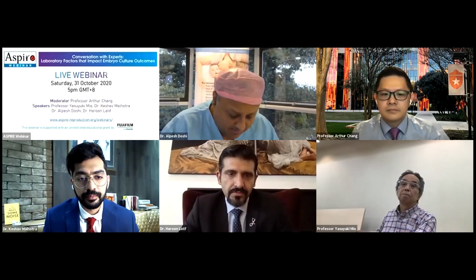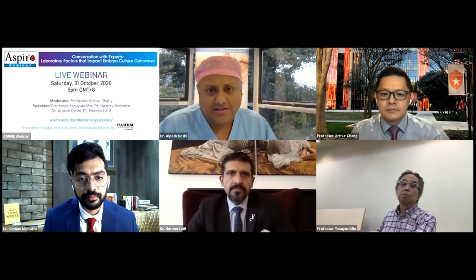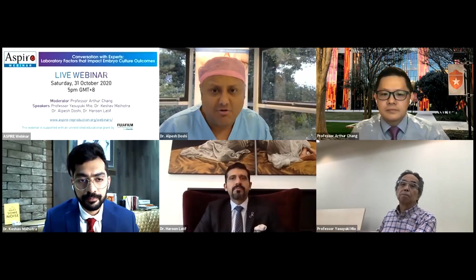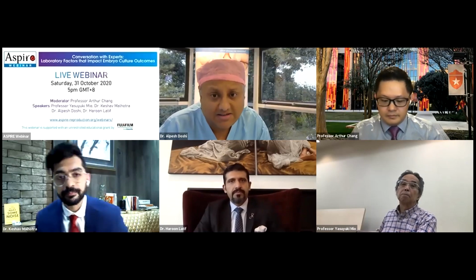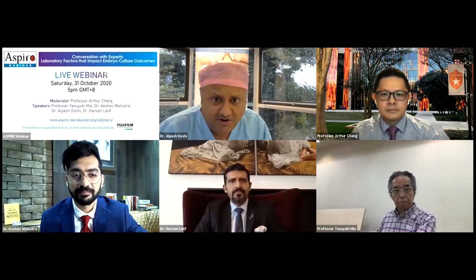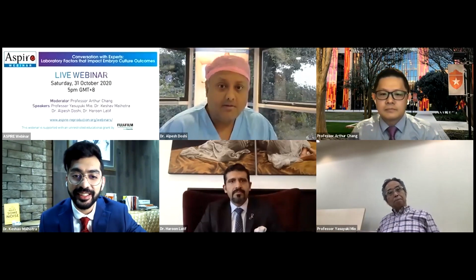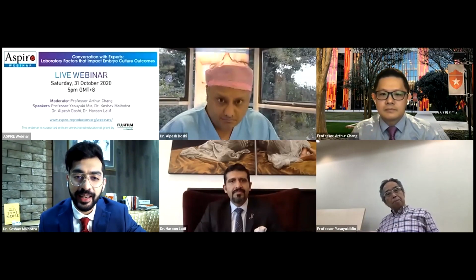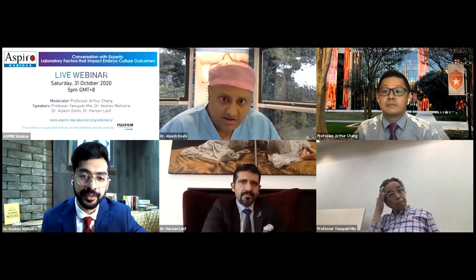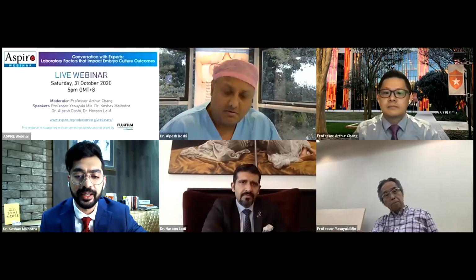And secondly, you made reference to doing day 6 transfers in your setting. Now, the view here is that we avoid day 6 transfers totally, and that if you have embryos on day 6, then we vitrify them and then transfer them in an FET cycle. But you seem to allude to the fact that you do fresh transfer. No? Sorry. No, okay. I'm sorry. So those were day 6 FETs, where the blastocyst was at day 6, but it was transferred at day 5. Perfect. So I'm sorry if I've missed that during the presentation.